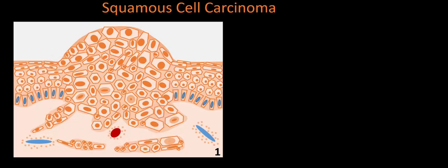Before describing the cancer, let's look at a normal span of epidermis on the left, because understanding normal helps us appreciate what's abnormal. Notice the orderly progression from the basal cell layer at the bottom all the way up to the stratum corneum at the top — in direct contrast to the center of the image. There are four features that distinguish this lesion as an invasive squamous cell carcinoma.